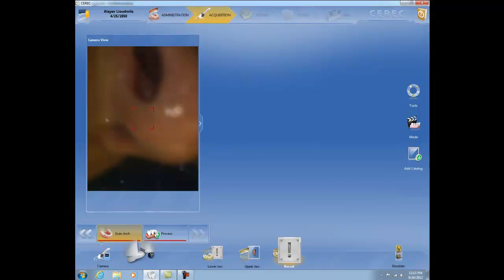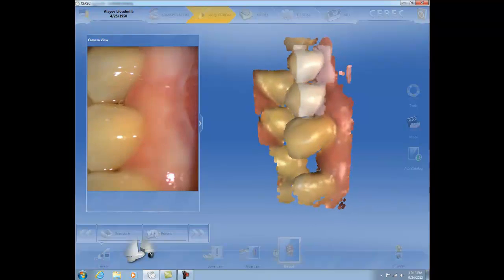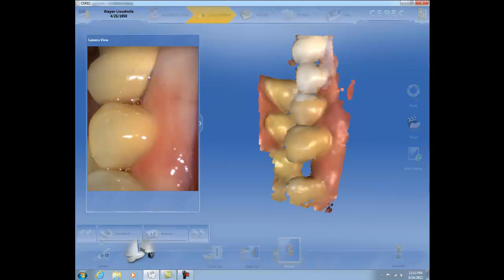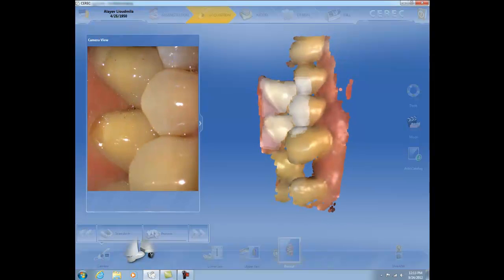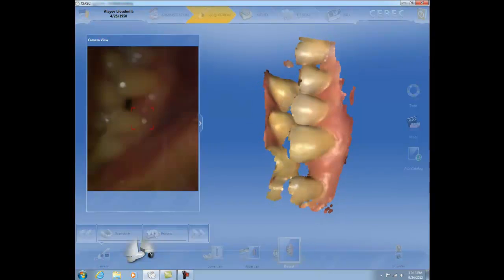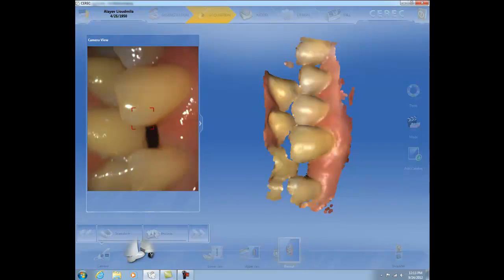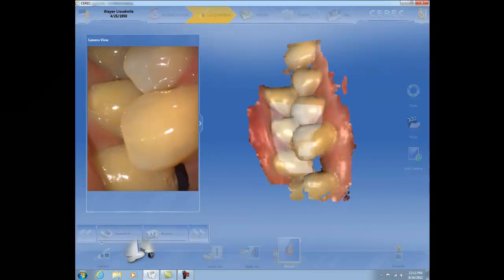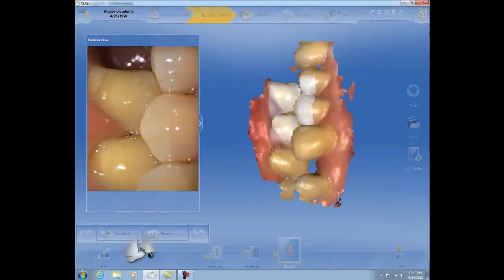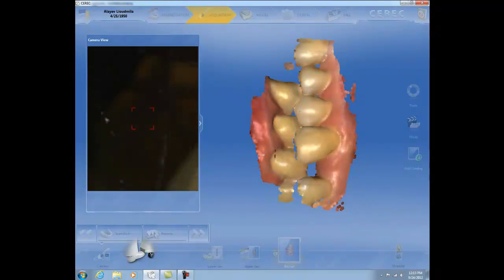Again, the Omnicam is beautiful. It gives you so much data, and it's a buccal bite. It's collecting the data and it scans so fast, and it's better visually too. You can see clearly the teeth, the cervical parts and the gums. You can see it's scanning again, to make sure to include the inside edges of the upper teeth, so my buccal bite will stitch smoothly.